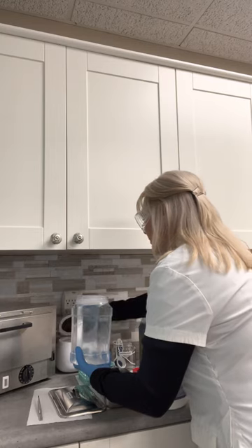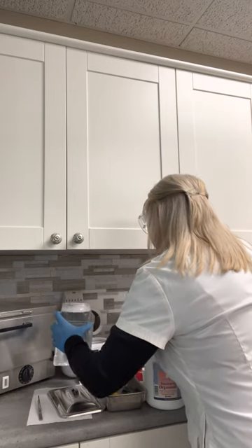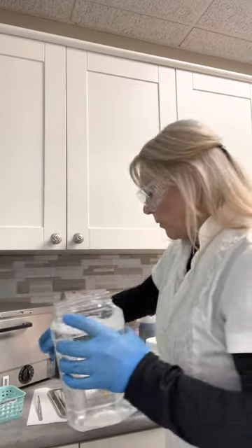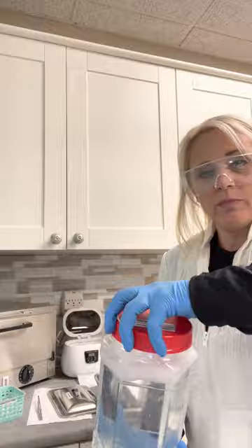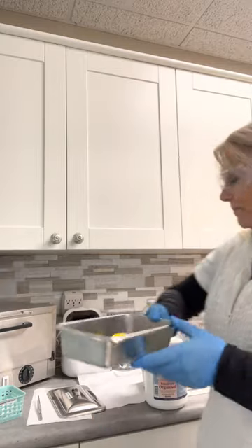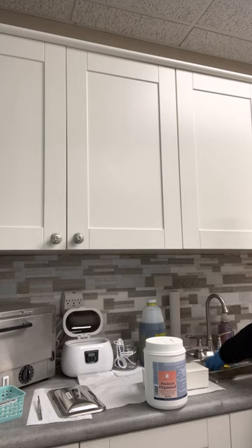I'm going to pour that into my sonic cleaner carefully without getting it everywhere. Some of my items are quite large, so I want to make sure I fill it up high enough — especially that clip — so that it's completely submerged and everything will get cleaned. The sonic cleaner is ready. I will take these and rinse them. You can put them in a strainer or rinse them into your little disinfection bowl. You just want to make sure that you remove any organic material from them prior to putting them in the sonic cleaner.